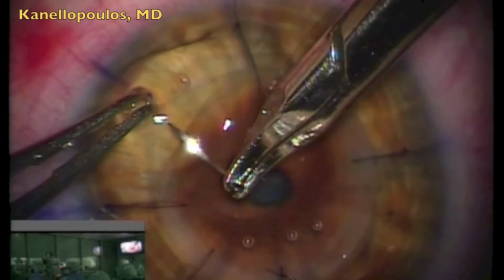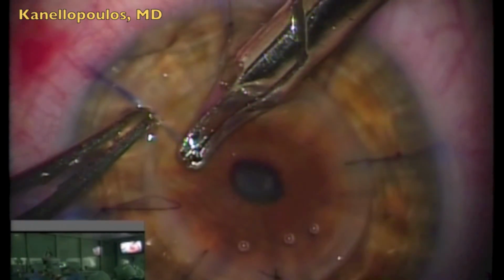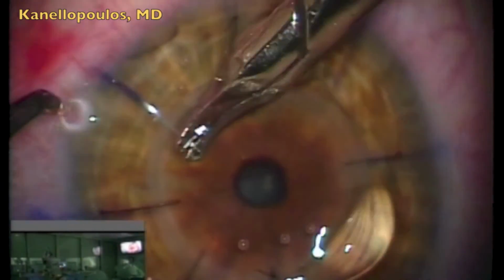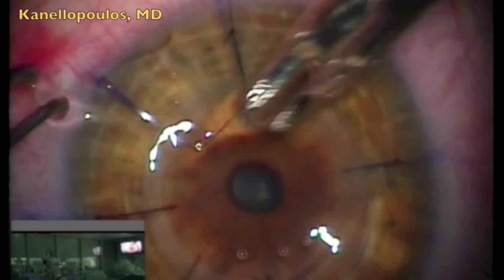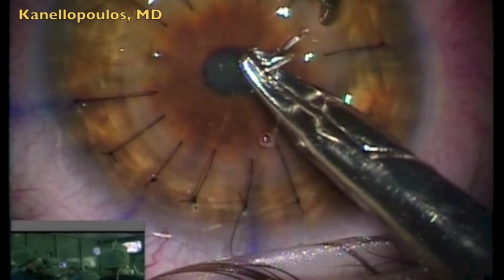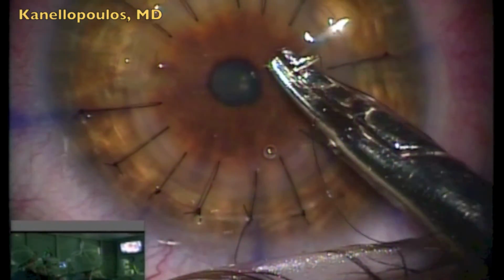Here, one of the last sutures, probably one of the most difficult sutures for right-handed surgeons, the 5 o'clock suture. Again, same concept here. We're trying to go as deep on the donor, through over actually the endothelial side, and do the same in the host, and last suture of this series of 16 interrupted sutures.